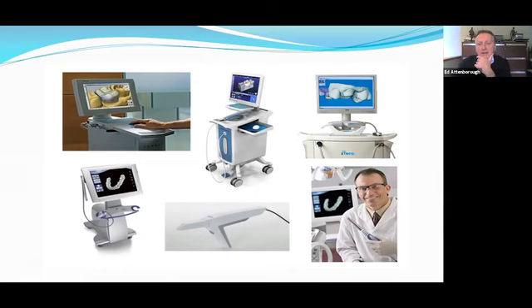So a couple of things that we can see straight away in intraoral scanning that are going to be probably more restrictive than desktop scanning. The first one is, obviously, there's only a certain vertical dimension that we can have here for the comfort of the patient, particularly if you're scanning in the molar region. So that restricts the overall size of the tip of the wand, and the window here therefore can only be of a certain size, and that gives only a certain size of the viewport that the scanner can see.